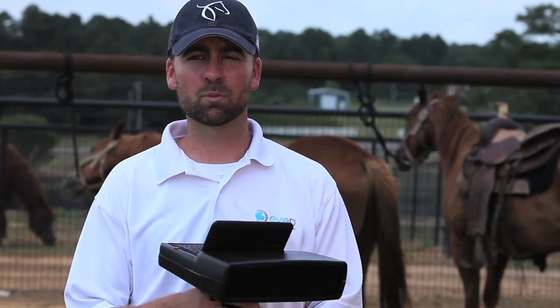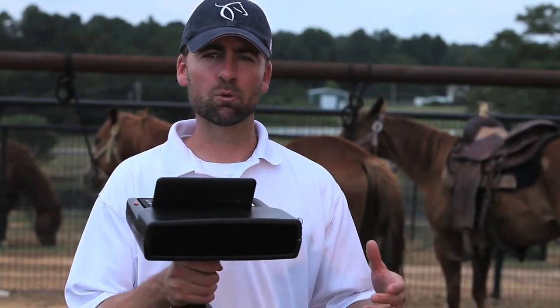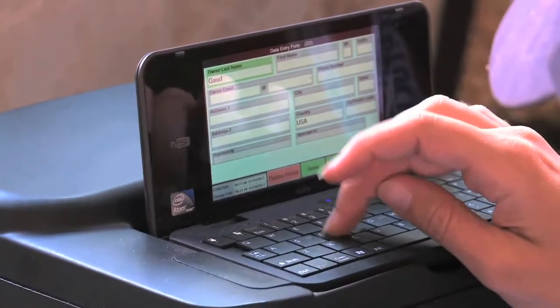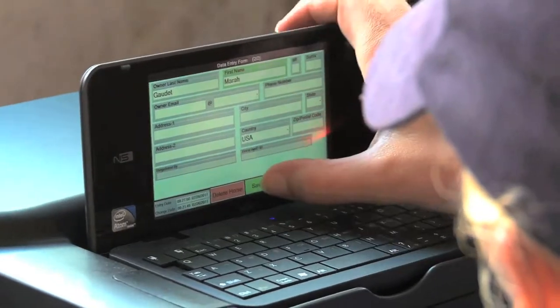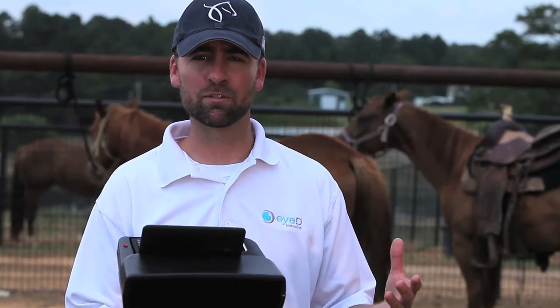So how the process works is a user would go out into the field and enroll 1, 100, 1,000, 10,000, doesn't matter how many horses, using a specialized camera. They would get the iris images as well as up to 4 still pictures of the horse and other types of metadata that could be associated with that horse file.